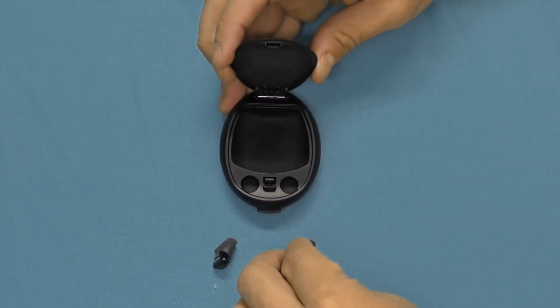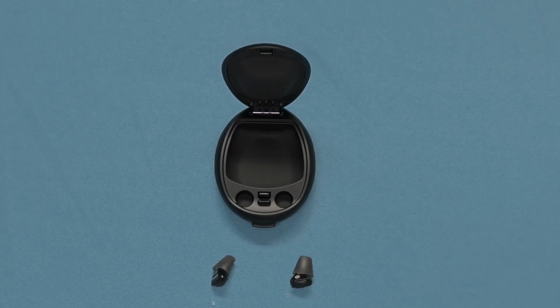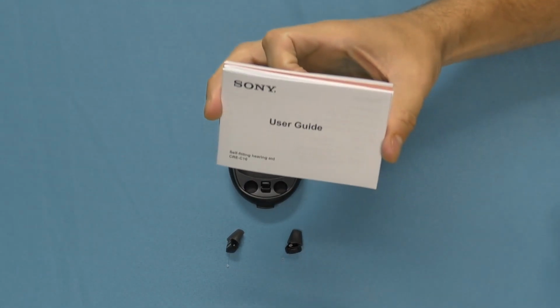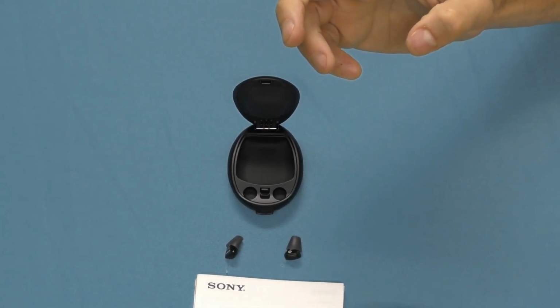Now, my observation here is looking at the size of the actual units. They're not going to be quite as aesthetically appealing as the picture on the front of the box makes them out to be. However, that is going to depend on the size of your ear canal. So if your ear canal is large enough, they will be pretty discreet.